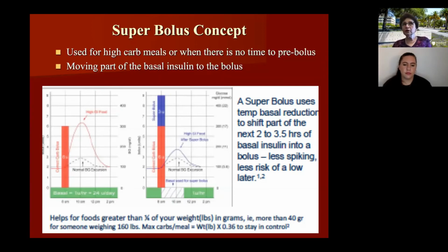And then when you look at the total carbs entered, that would be, for example, 30 grams or 40 grams per day. So more clearly, 30 grams per day, some days it's possible, but for most days it's really, really difficult to stay there. And again, some of the slides that I included on the protein and fat coverage, you would add that as carbohydrates. So to have such a small amount of carbs is not realistic. So then you would say, I probably forgot to enter some of the carbs, and probably my basal is higher and covering a lot of my carbohydrates.